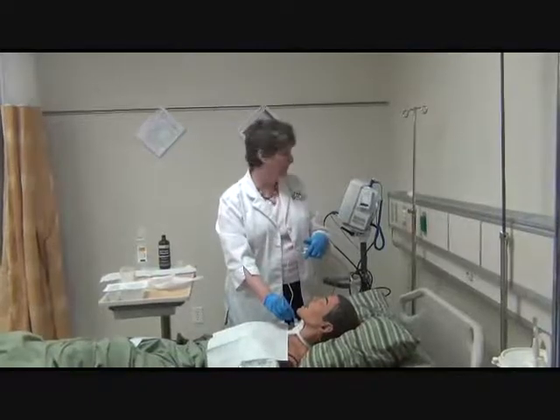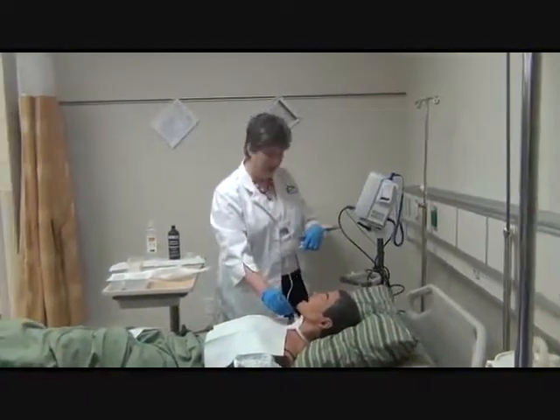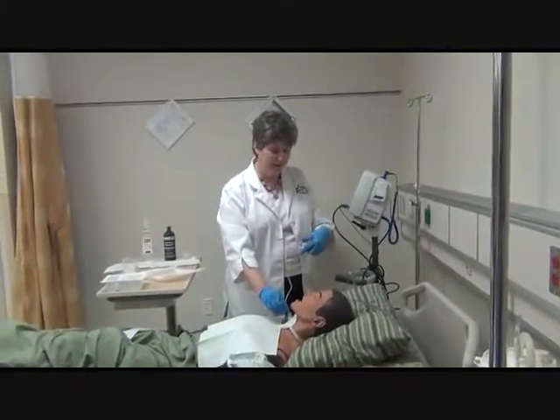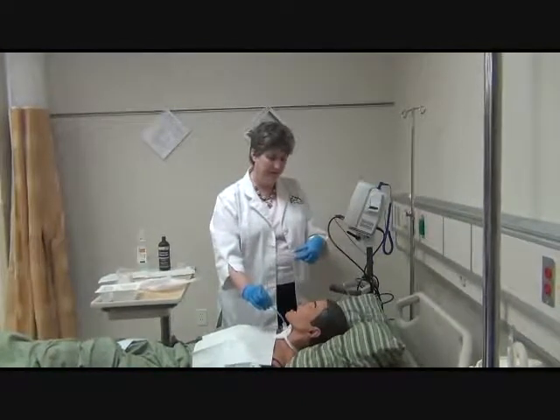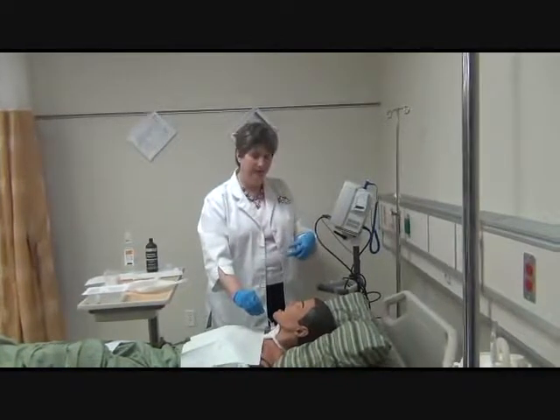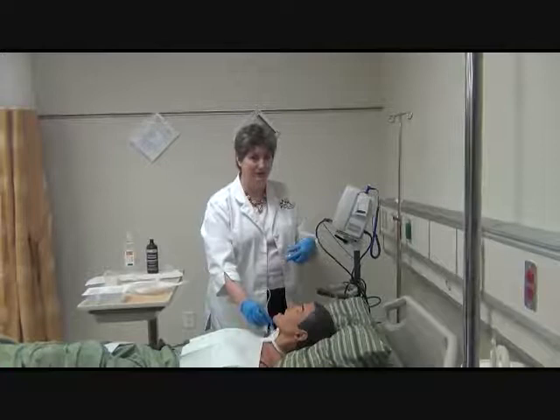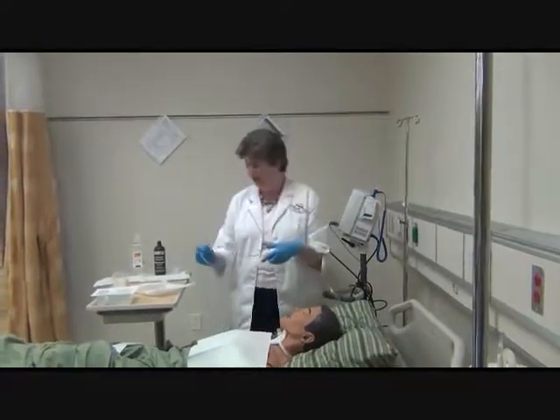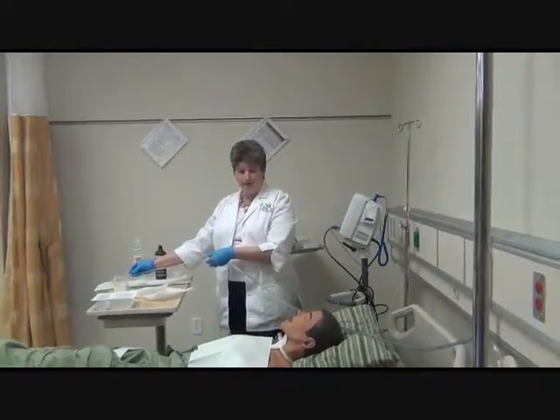And watch your O2 sat monitors. So I'm watching that. I know that that's good. And I'm going to go down. And at the point that I put the catheter in and I'm ready to remove the secretions, I'm going to put my thumb there and come back out. And you can do intermittent. If it's really thick secretions, you may find you have to have a little longer pressure on there.